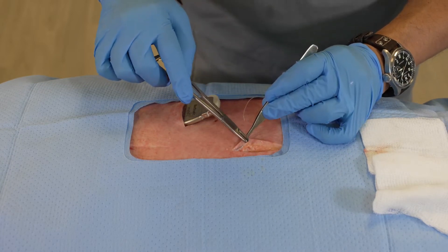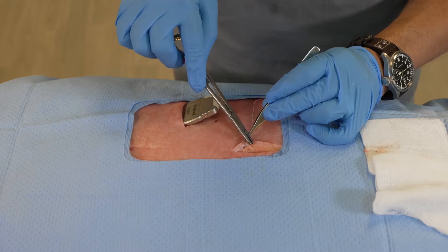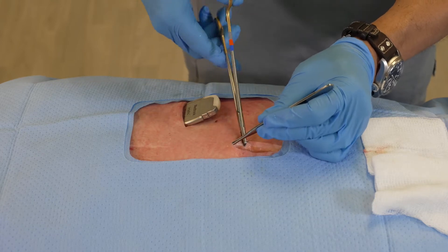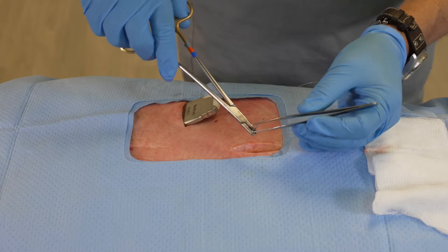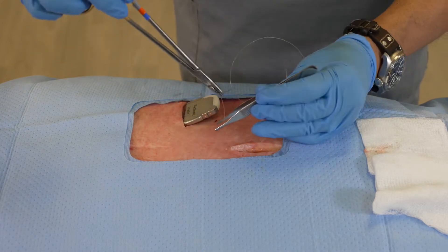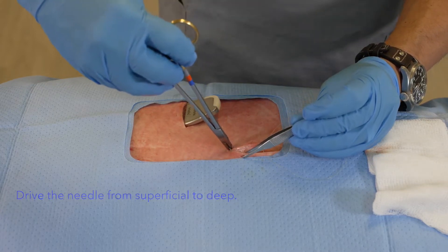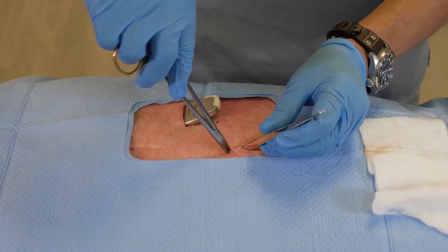The first thing I'm going to do is identify the dermal layer where I'm going to be placing the suture, and I'm going to drive this suture towards the apex of the wound. Once I have this positioned, I'm then able to drive the other side in the same manner, coming from the apex back towards my original insertion.